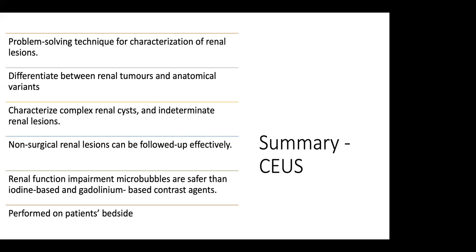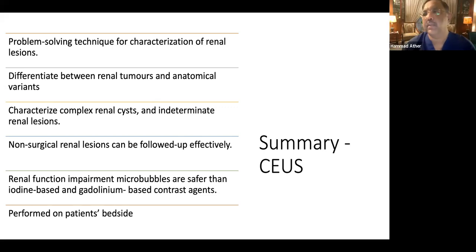Yeah, I think this is absolutely correct, Marco, because even the grayscale ultrasound or Doppler ultrasound pictures that you see are the ones which the sonographer, sonologist or radiologist considered important and relevant and took an image of, and this is what you see. So this is really a very static image of things. You really need to rely on his or her word about the interpretation of what the radiologist has actually seen. So yes, you're absolutely right.